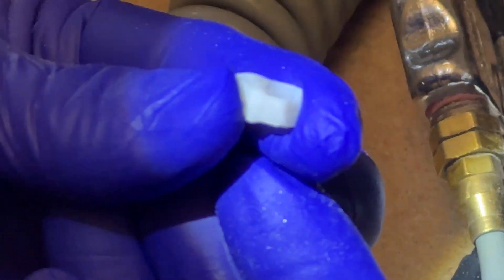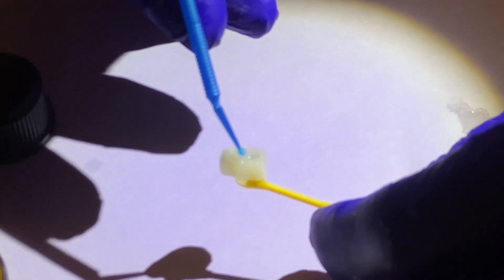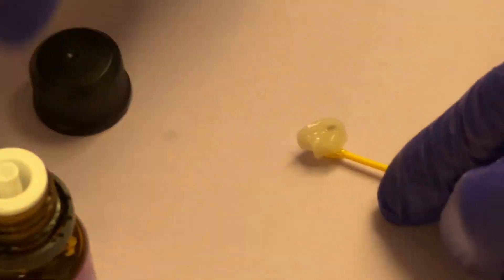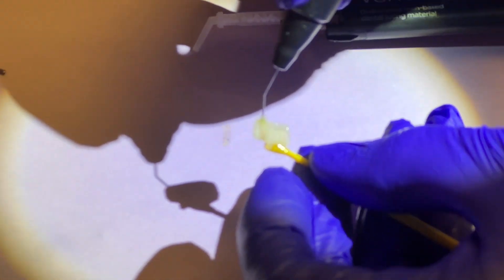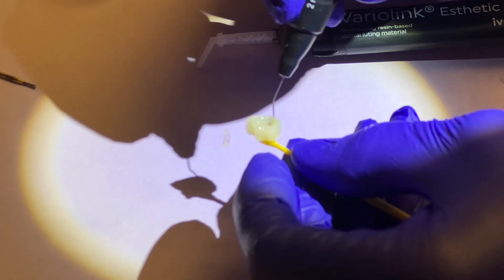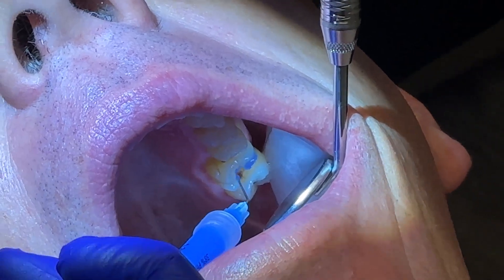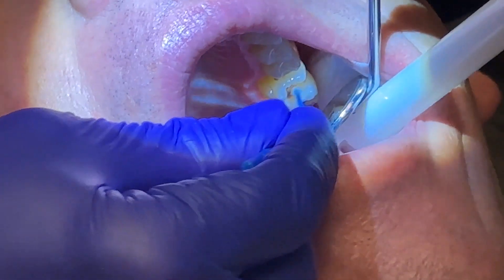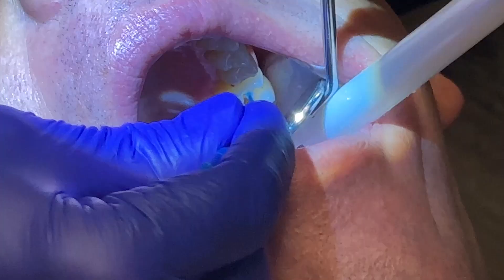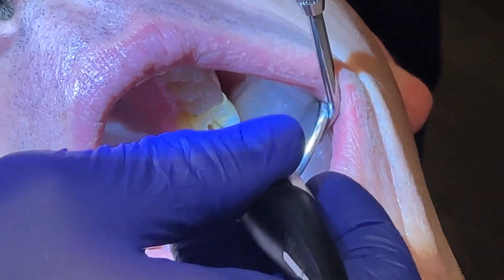A little sandblasting freshens up the surface to allow the bonding material to penetrate properly. Then we're going to use some Monobond, which is a type of silane. Next step after this, we're actually going to use Adhese, which is a universal bonding agent. And in the mouth, we're going to first add etch — with an awesome view of my nose hair. Then there's Gluma, which is going to help decrease sensitivity. And then also the Adhese bonding agent, which you light cure — and you can do it a second time if you want.